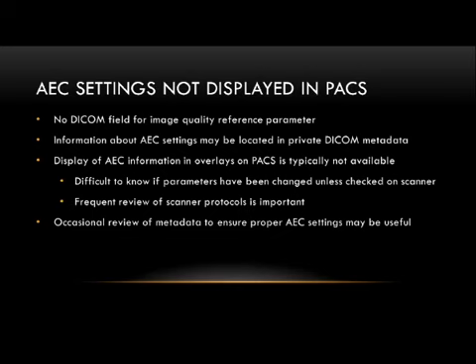So that's quite important. Hopefully, as we move forward and more stuff becomes standardized, some of these will become proper DICOM fields, and we would be able to see them as overlays and track them. But today is not that day.